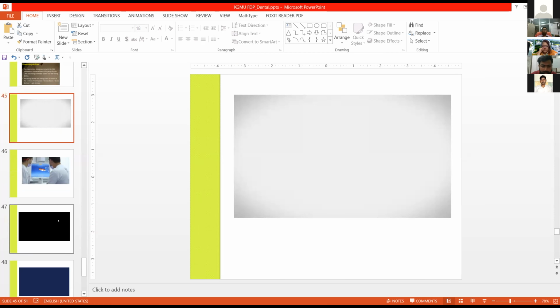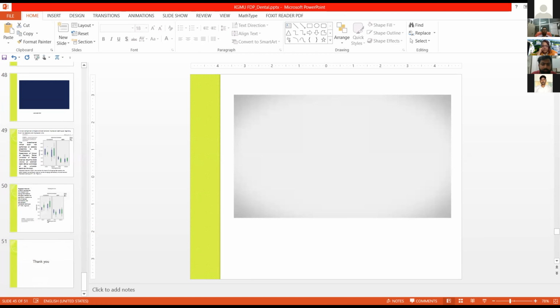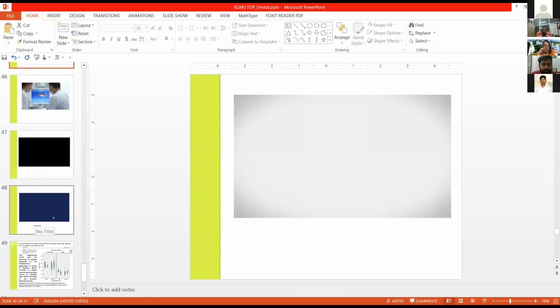For dental purposes, as sir said, we have different types of options. The first is a tactile scanner, where the pin travels from one point to another to capture the data, but that was a very old model. Then we came up with the laser, but the laser still cannot pass angulated areas, which was a drawback. Then we came to white light, but the normal light and the white light are the same, so the scanner is not able to differentiate what it is scanning.